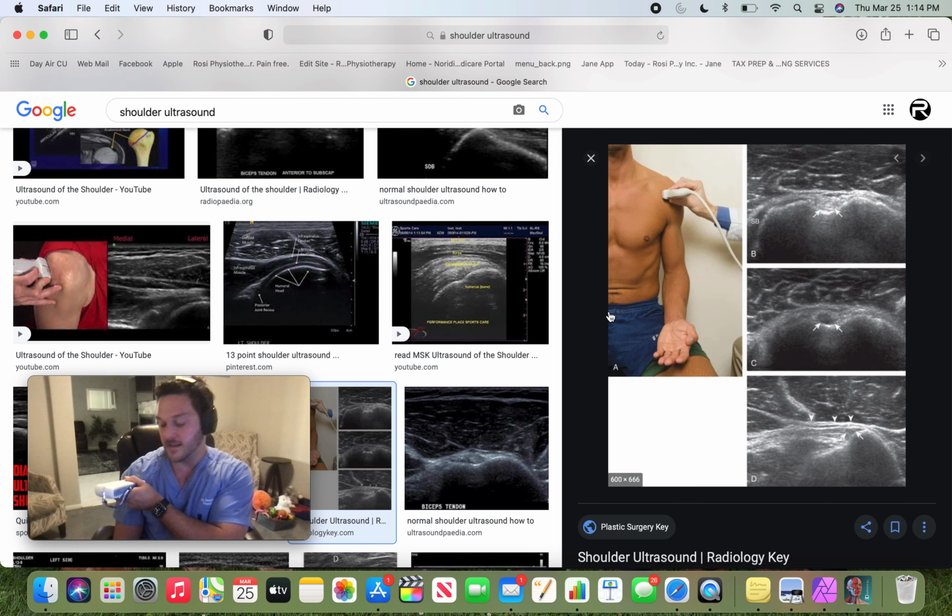The biggest common thing clinicians will do in the beginning, which technically isn't wrong, you just have to make sure you identify your image correctly, is they'll start with this on the right, and they'll always remember the image with this being outer or lateral. By doing so, they'll do this, and then they'll flip the probe. Notice I flipped the probe to do the other side, as opposed to holding it here, nice and strong, angled this way so you can hold it real close, give it some pressure, and then let go. Notice I did not rotate the probe at all, and then boom. So now this is pointing technically medially, but it gives me the same form of the image.